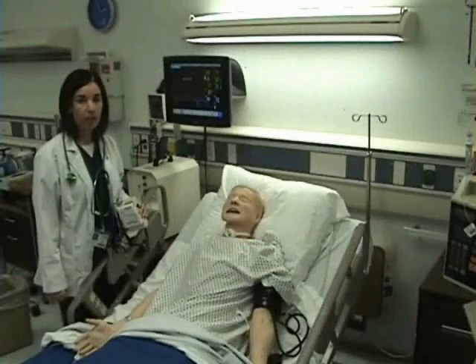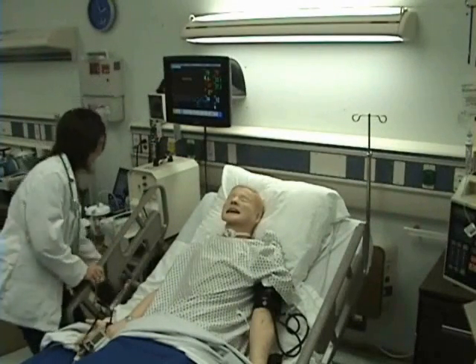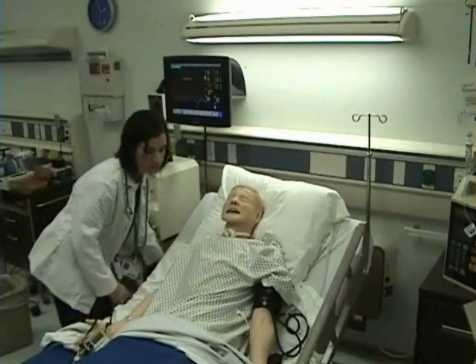This is how to take vital signs. I will begin by checking my patient's temperature, putting my side rail down.